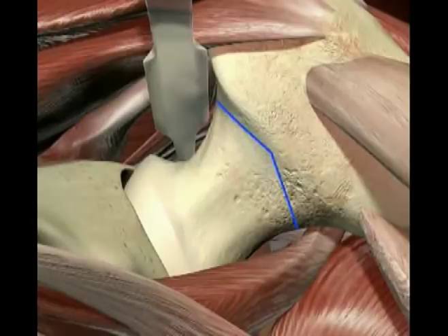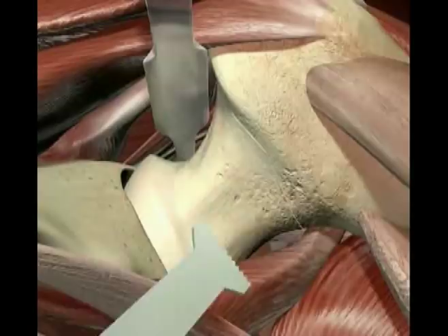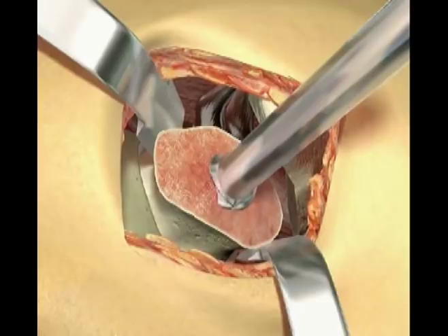After completing the osteotomy, a chisel is used to flip the femoral neck toward the front. This will allow a corkscrew to be introduced into the femoral head. Follow the central axis of the femoral neck into the head, not into the neck. Turn the corkscrew several times and remove the femoral head.